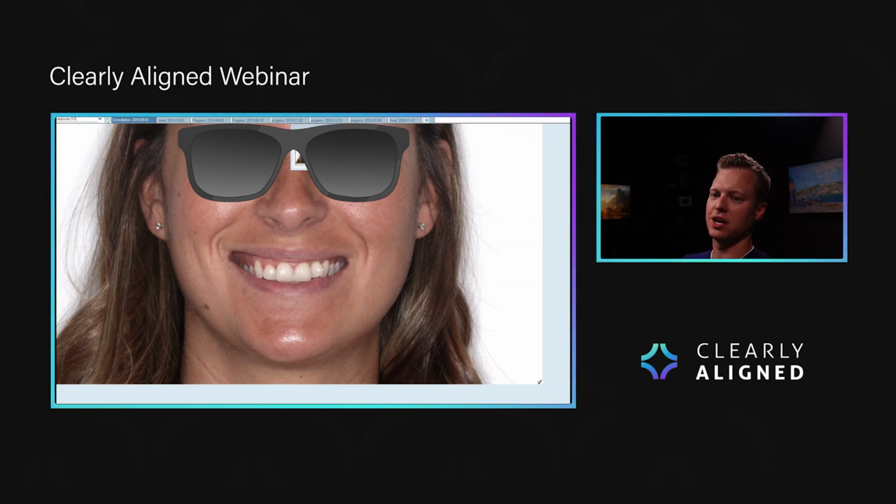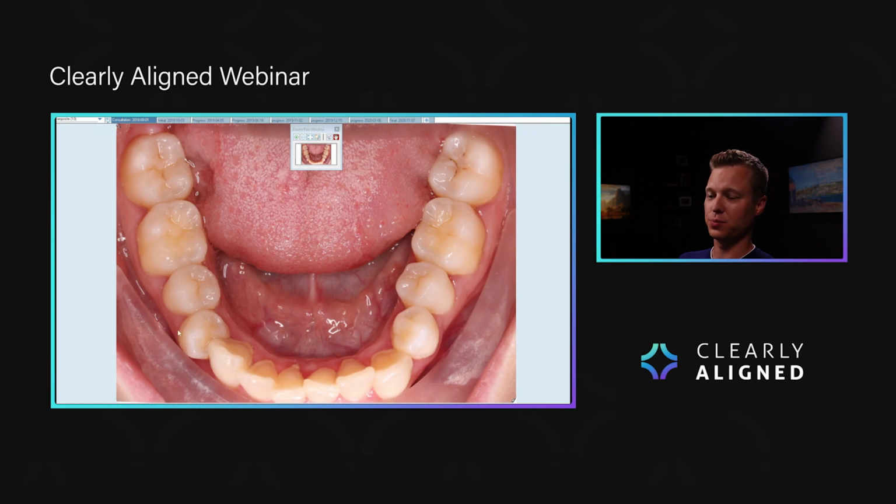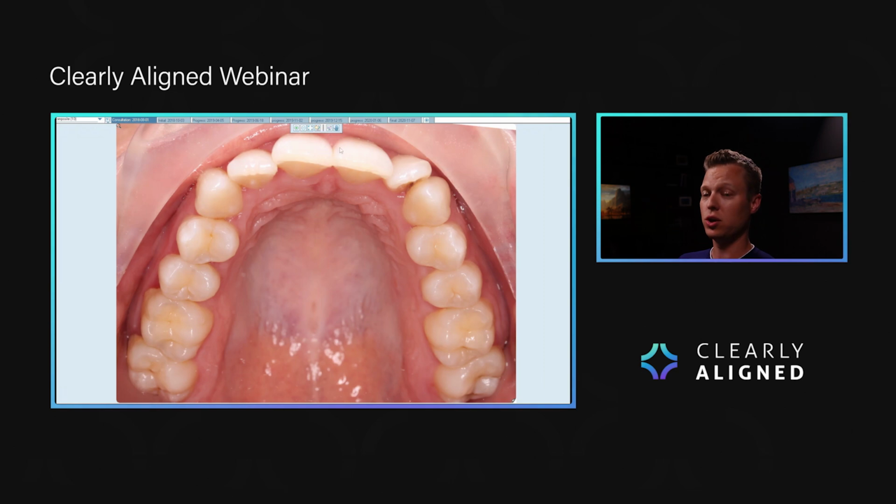Well, she comes in, she's got crowded teeth. That's her chief complaint. But she also says my smile doesn't look great, like she knows it's kind of crooked. We look at the teeth, pretty straightforward, right? You've got some basic crowding going on the lowers, same thing on the uppers. You could utilize optimized attachments here, so just Invisalign standard pre-canned attachments that come to you, or you can change the attachments, and that's what we'll do in this case, and I'll show you why and where.